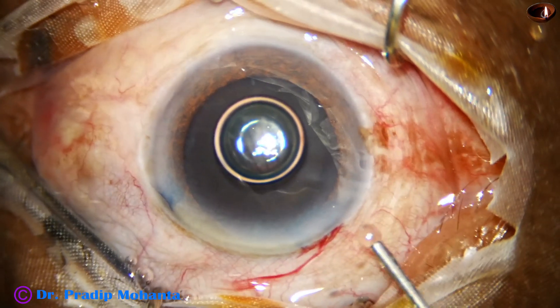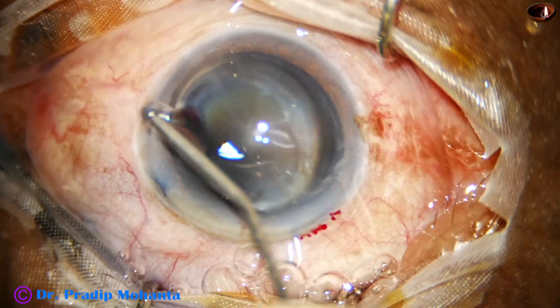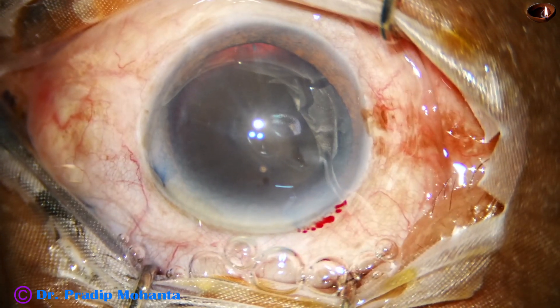And now, I fill the anterior chamber with 2% hydroxypropylmethylcellulose. Some visco is applied over the cornea.